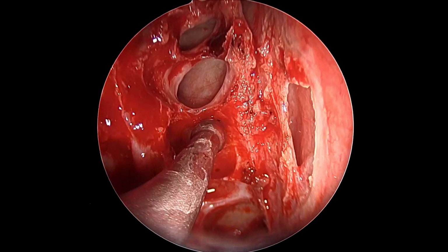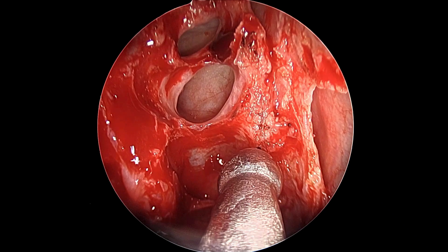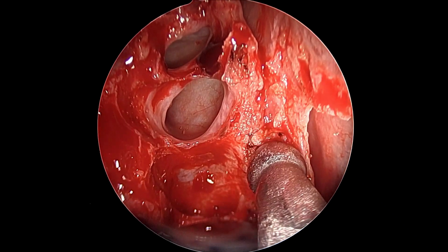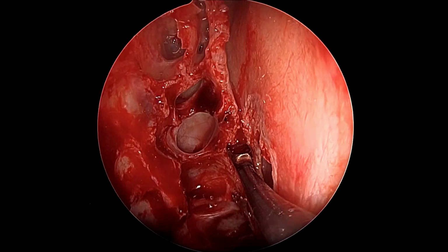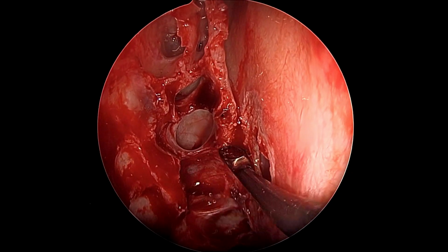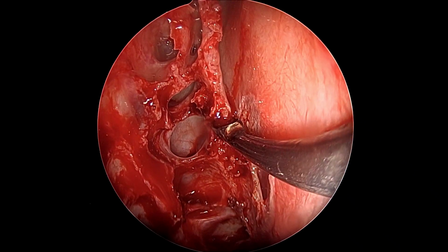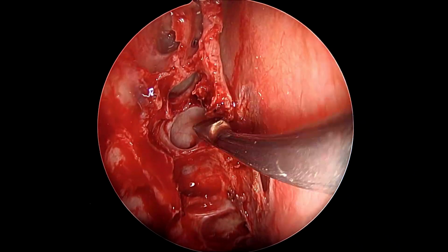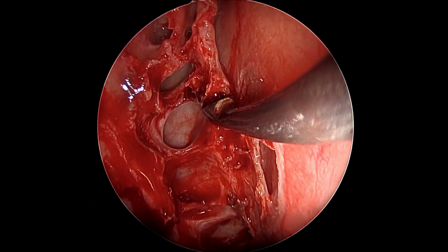So now one can appreciate the difference of views between the 0-degree scope and the 70-degree scope, which points upwards. With the 70-degree scope, we are mandated to use more and more curved instruments so that our field of vision is not blocked. Here we are using a curette to gently fracture and isolate the defect and to make it maybe even slightly larger. Very small defects are hard to close.